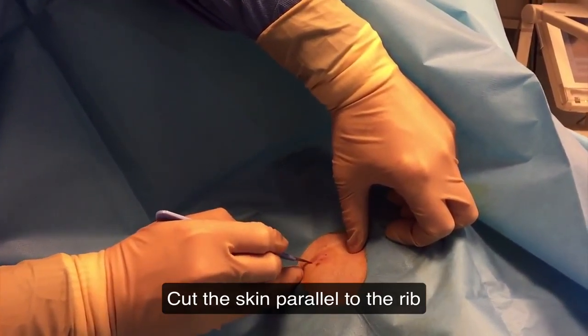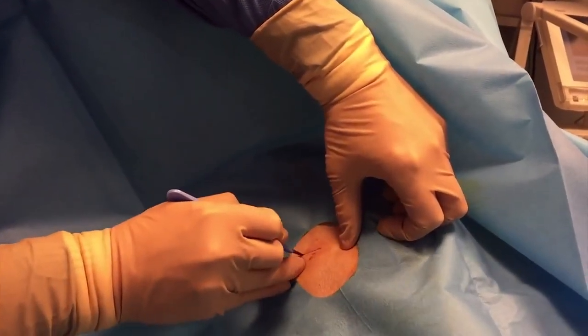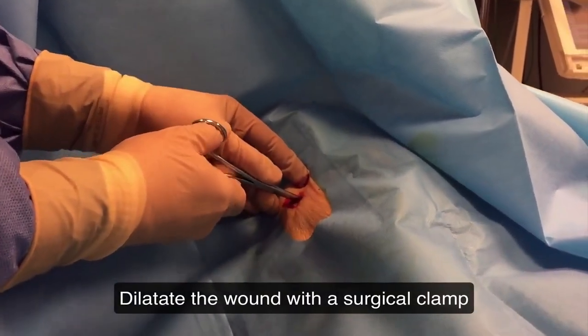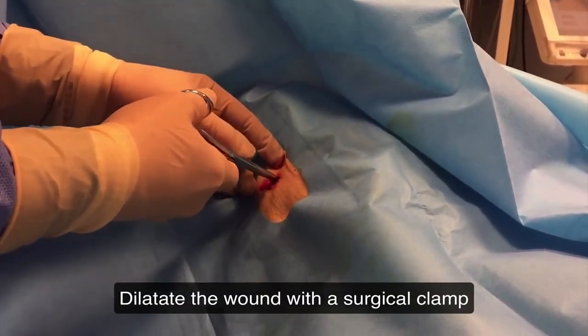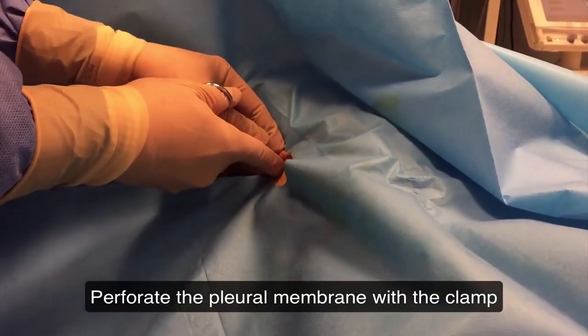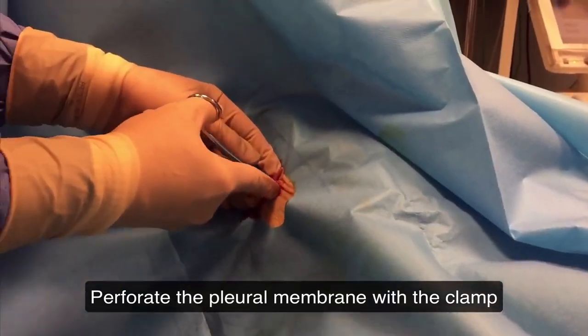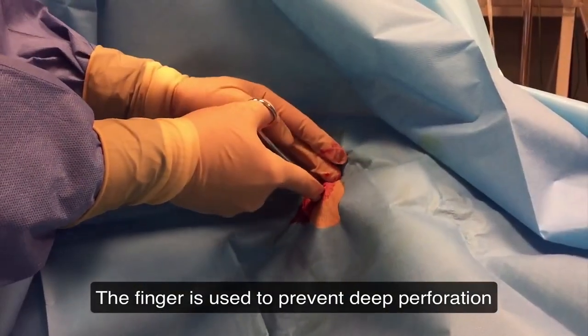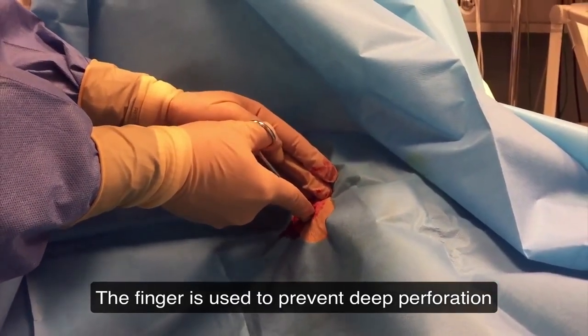Make your skin incision 2 to 4 centimeters long and parallel to the rib. Now use your surgical clamp to dissect the subcutaneous tissue. Perforate the pleural membrane using your surgical clamp. You can use your index fingers to prevent deep perforation that might damage the liver or other tissues.